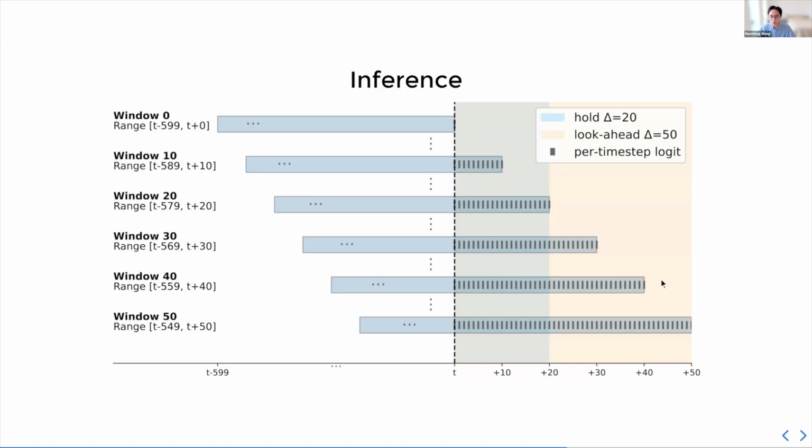It really depends on how responsive you want the model to be, and also how often humans modulate their gesture changes. As I said earlier, if you try to open a hand 10 times a second, that's probably very difficult. A reasonable ballpark is 5 to 6 times a second. If your look-ahead is shorter than that, then you can stay responsive while avoiding noticeable delay. Thank you.